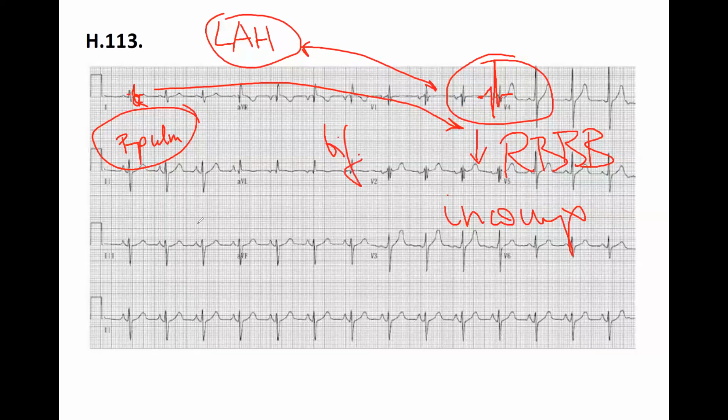Exactly. Hypertrophy, if any? Not in the ventricles, I don't think. No, that's it. ST segment is okay. There is no other sign. Okay, good. All right.